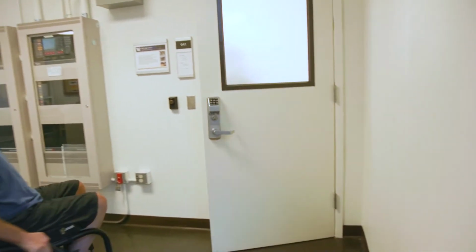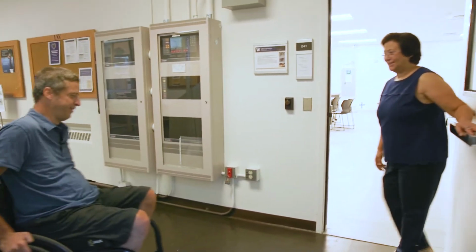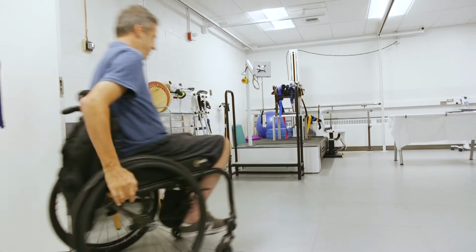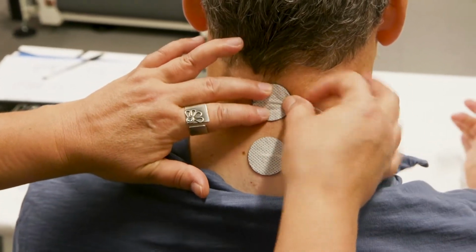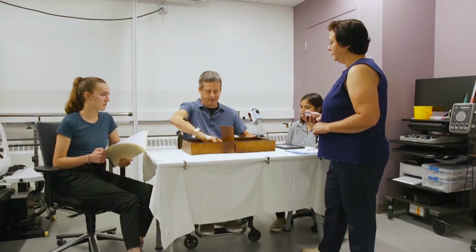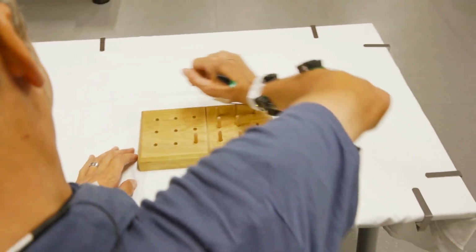A typical day at the trial would be to roll in. Fatma and Lori would work with me for 2 hours of just sitting with a stimulator device on my neck, doing simple exercises that I could barely do.